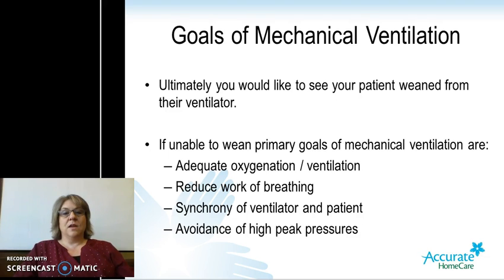Oxygenation is the process of bringing O2 into the body. Ventilation is the process of getting rid of the CO2. Ventilation is slightly more important. If we cannot get rid of the CO2, we cannot take on the oxygen. We want to reduce the work of breathing. We want to assure that the patient and the ventilator are in sync with each other, and we want to avoid high peak pressures as much as possible.